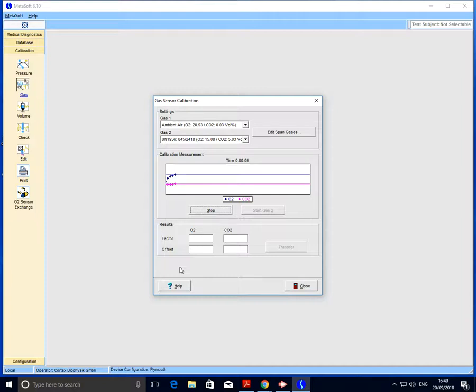This will take anywhere between 30 and 90 seconds, providing the Cortex is sufficiently warmed up. This is an ideal time for us to then prepare gas two.